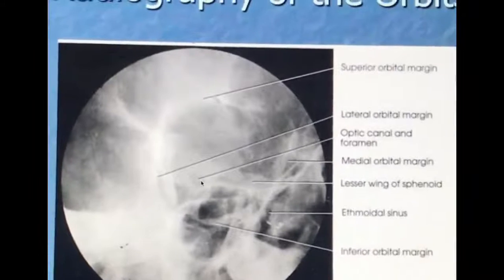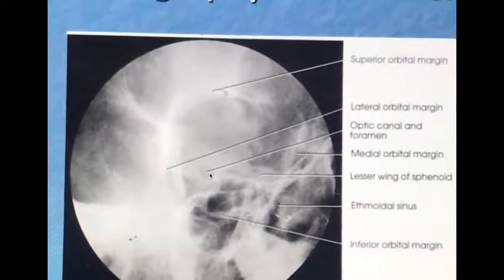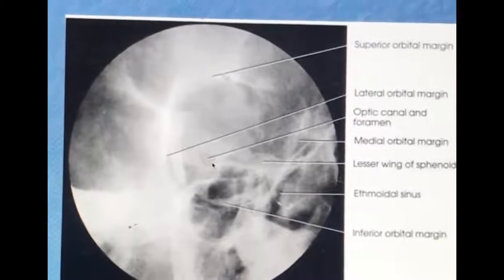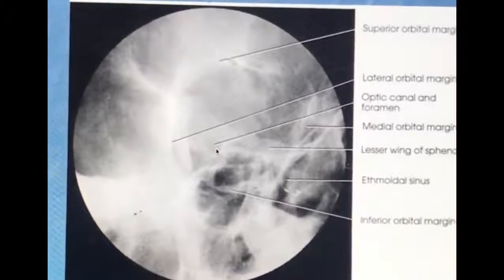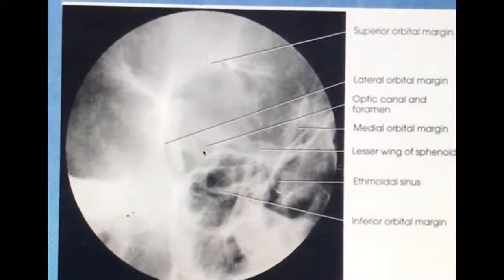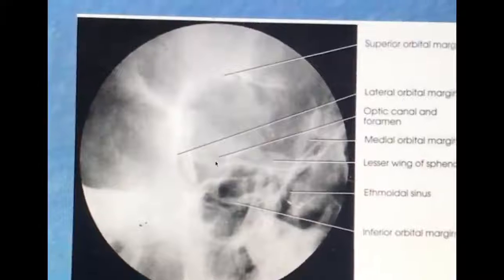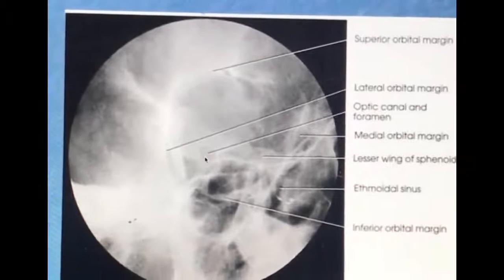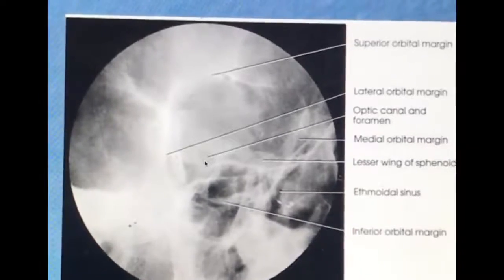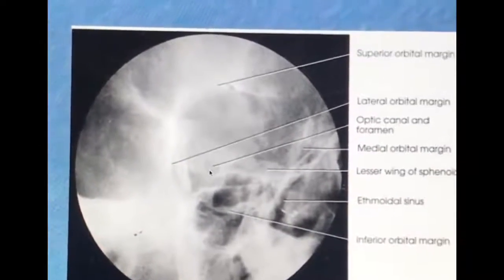In terms of exposure, you should have sufficient exposure to be able to visualize the optic foramen, and no motion is evident when you are able to see sharp bony margins. Remember to take note of your medical legal requirements. Your area of interest should be in the center of your image, and remember that you need to have very close four-sided collimation.